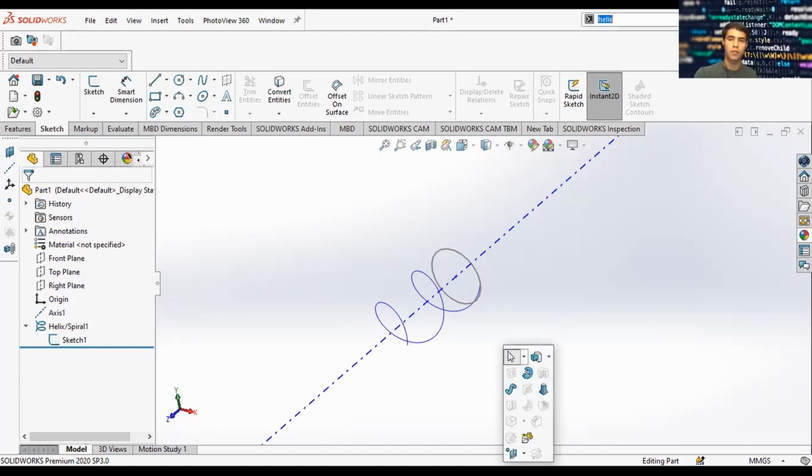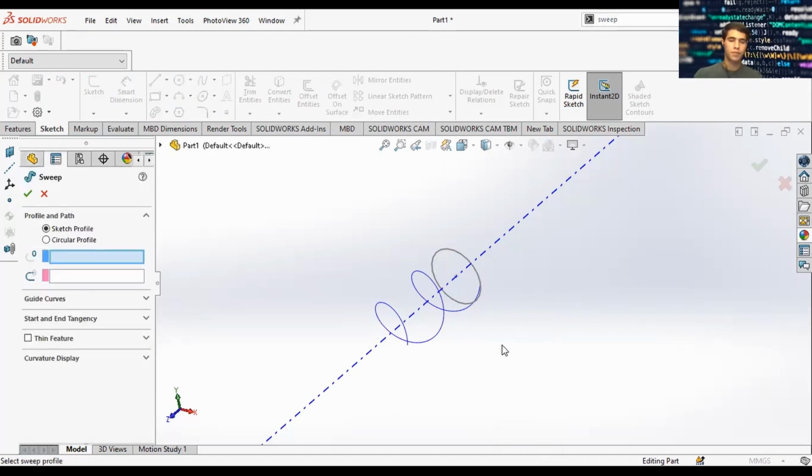We want to make it a solid body, so we're going to do a sweep. In this case, the cross-sectional profile we want to sweep is a circle. Or if you want to make a special profile, like a triangle-shaped profile or a square, you can do that. We're going to keep it simple.